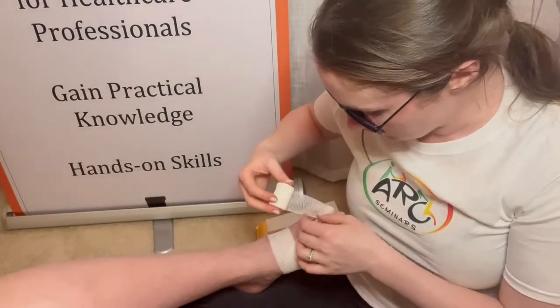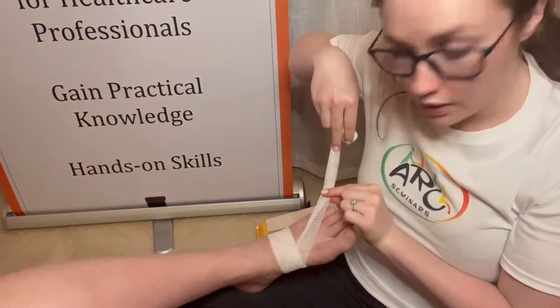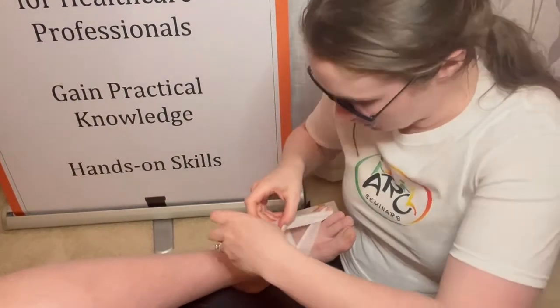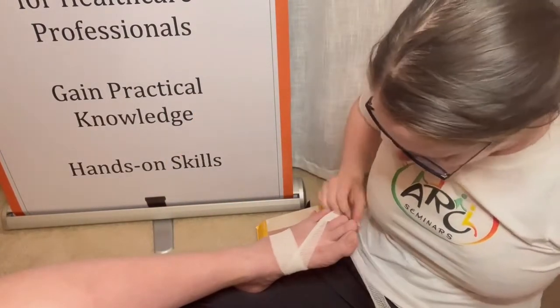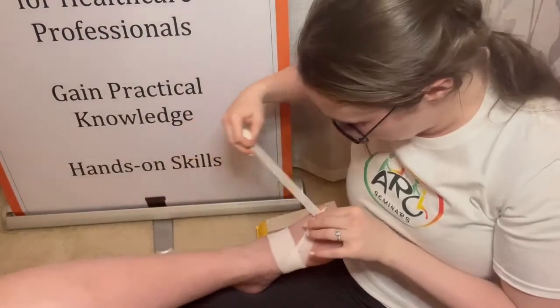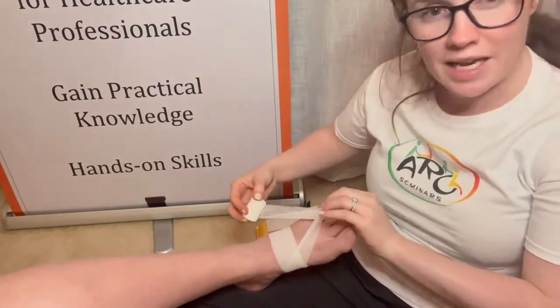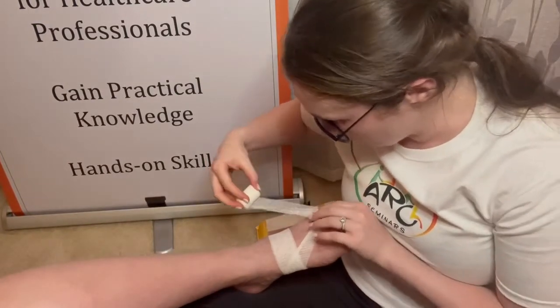So if your gauze is a little long, you can always fold it like so as you go and bring the folded gauze across the foot. I go around the toe, possibly 2 or 3 times, making sure that most of my gauze is around the top and middle part of the toe. We do not want to get it down at the base of the toe where it meets the foot, as that can kind of irritate your patient. So we keep it up here at the top.